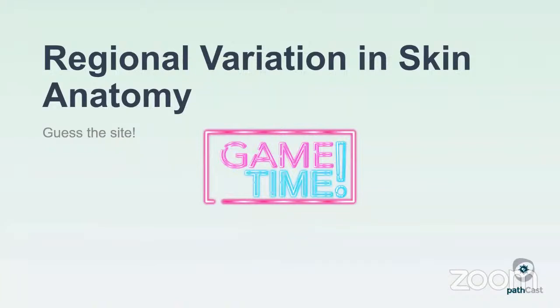With that, I'm going to move on to regional variation in skin anatomy. And I like to consider this kind of a little game, guess the site. So I'm going to present 6 different anatomic sites. And before I throw on the answer, I'd like you to think really quick, where can this be coming from?